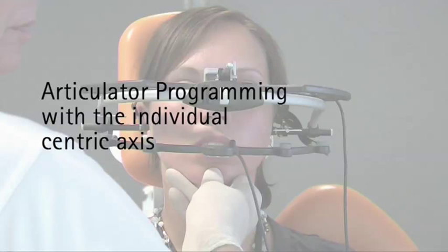Should the guidance by the operator not be sufficient, the position of the individual axis is indicated in the area of, or even behind, the ears. In this case, the ascertainment of the axis is to be repeated, or one should fall back on the arbitrary axis.